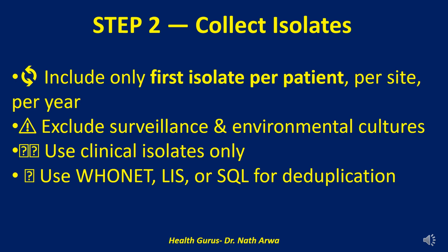Number 1. One isolate per patient. Number 2. No surveillance or environmental samples. Number 3. Only clinical, infection-related isolates. And number 4. Use digital tools to streamline the process. Get this part right, and your antibiogram will be built on solid ground.